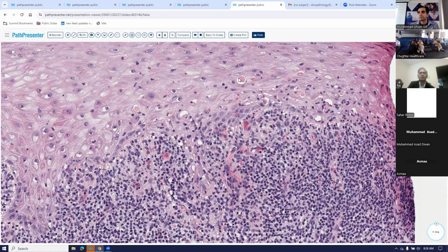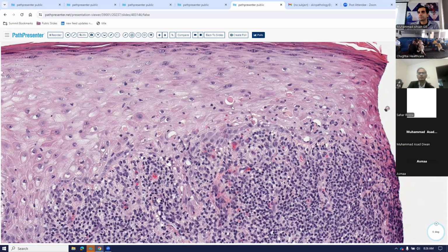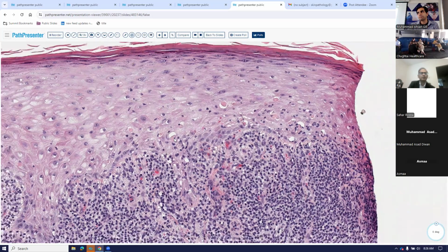And because they undergo apoptosis, you start seeing this dyskeratotic keratinocyte. Colloid bodies, dyskeratosis, many different terms people will use. But the underlying thing that you see is a very pink cytoplasm, and then the nucleus can be very pycnotic. So here you can see there is a very small nuclear edge here. And sometimes there is no nucleus. It depends on the level at which the cell was cut. Because it's a very small pycnotic nucleus, at some level you might see the nucleus, at some level you might not see the nucleus. So in some of these, you might only see the very pink cytoplasm, and in others you might see the pink cytoplasm with this very pycnotic nucleus. And these are all apoptotic keratinocytes. Or the other term that people are going to use is dyskeratosis, or colloid bodies. So that is part and parcel of the lichenoid infiltrate.